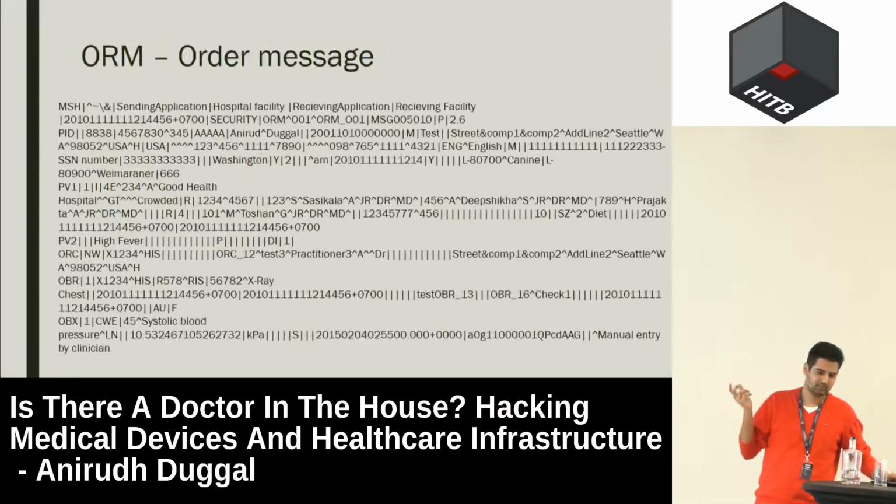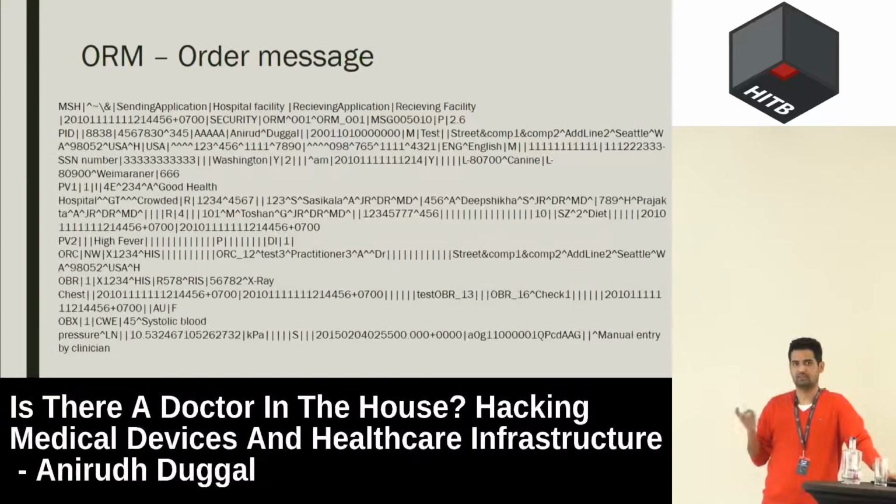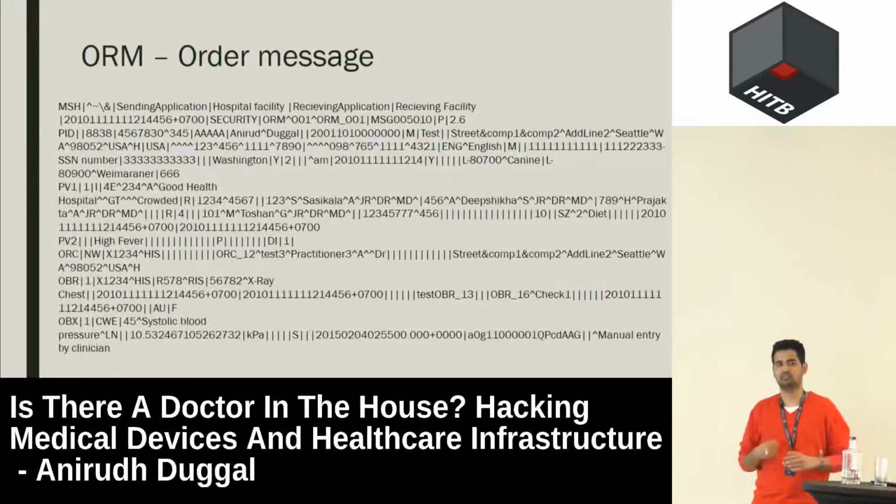Okay, second is the ORM message. This is probably one of the important messages. If you're lying on a patient bed in an ICU, this message would be sent really, really fast. So it contains all your vital readings.